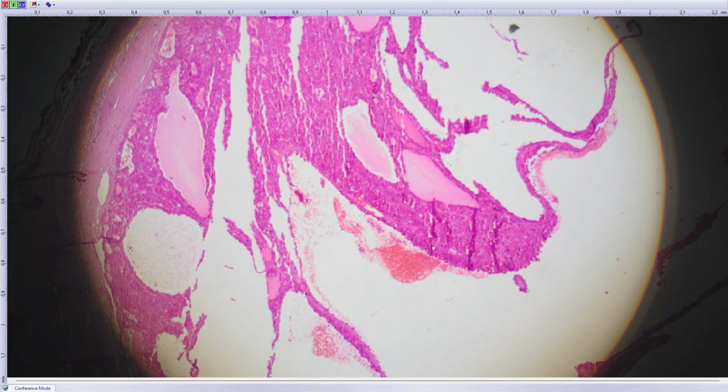I absolutely agree this is a tumor in the differential diagnosis, but my top differential diagnosis in this case is TFEB amplified renal cell carcinoma. Why? Because of the character of the granulation in the cytoplasm. It is not enough for ESC RCC, but the overall morphology fits relatively well in TFEB altered renal cell carcinoma.